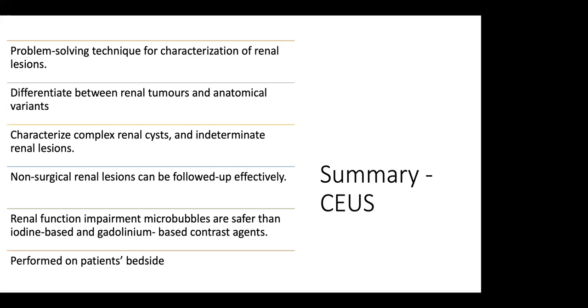All of this is based on requiring more than one injection. If you miss the vascular phase with the first one, you can give another dose to look at it more carefully. So based on this, I think carrying it out in an office situation would probably not meet the normal criteria of decision making.